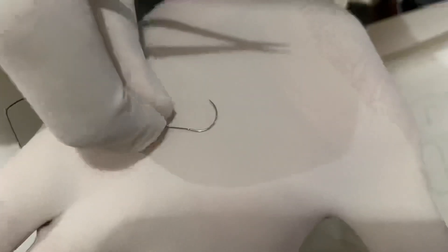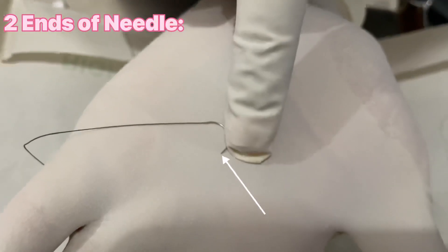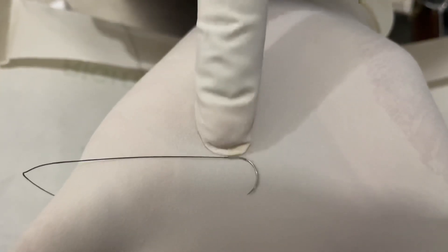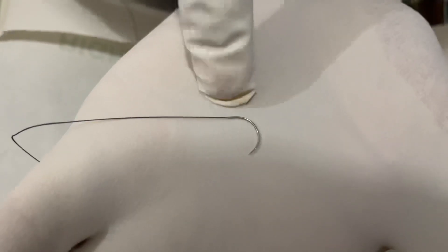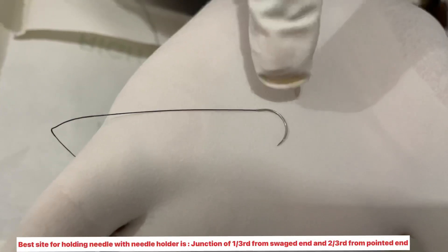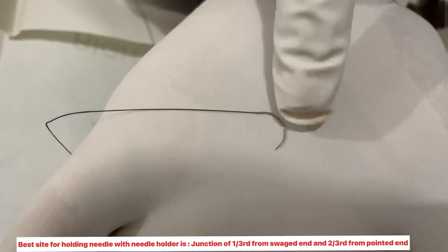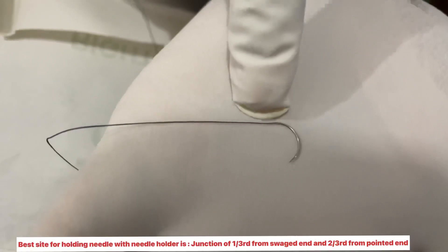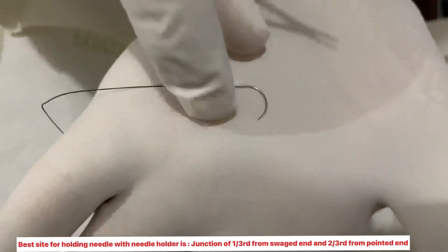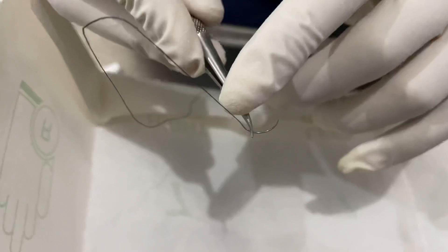Now, if you can see, there are two ends of the needle. This end is the pointed end of the needle, and this end is the suture end of the needle. The rule is that we need to hold the needle in the needle holder such that it is 2/3 away from the pointed end, and 1/3 away from the suture end. Likewise, we can hold it — 1/3 from the suture end.